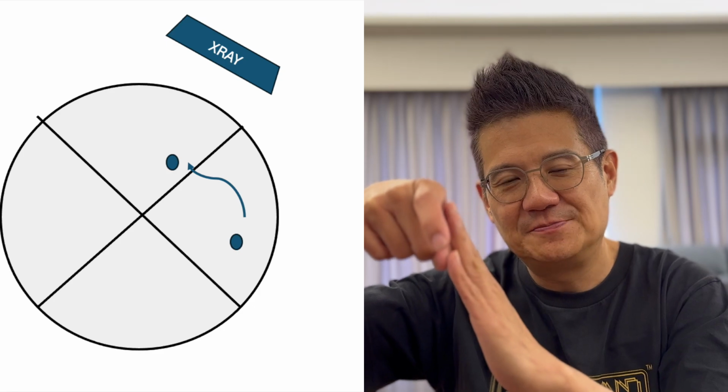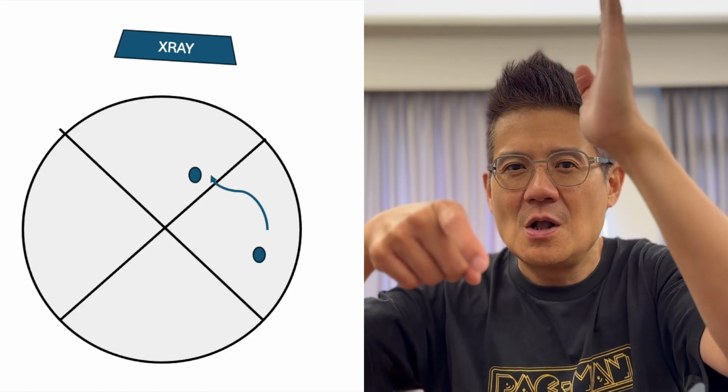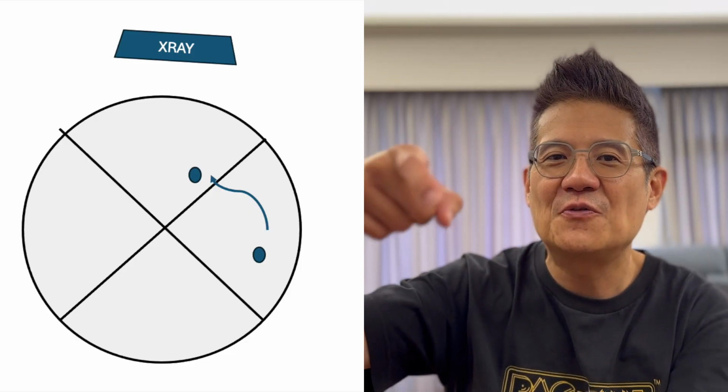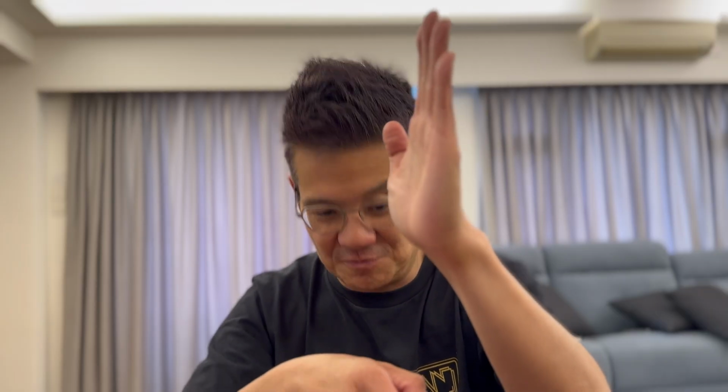You straighten the wire tip. What you do is you do not go to the other 90 degree view, but less, let's say 45 degrees, okay? The difference between 45 and 90 is that at 90 degrees, you will be further from the target. At 45, your wire will be nearer to the target, simply from the angle. If you push until you overlap at 45, this 45 view would then be the overlap view, and you straighten the wire there, which means you'll be staying within a quadrant. Now, if you go 90 degrees and you push till there, you'll be at the very edge of it, and you have a danger of dropping out of that quadrant.